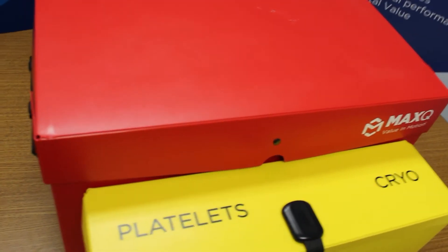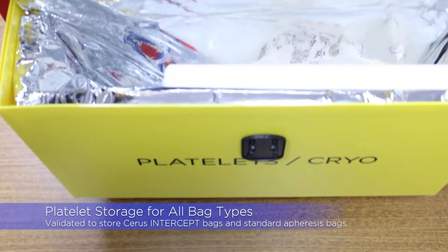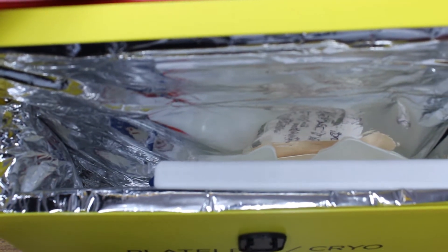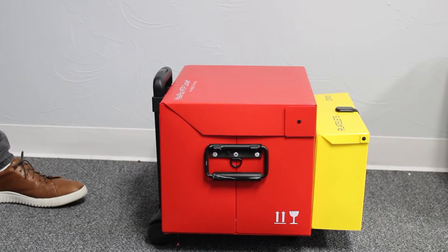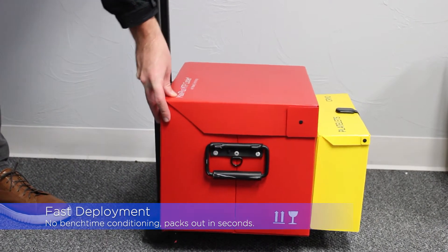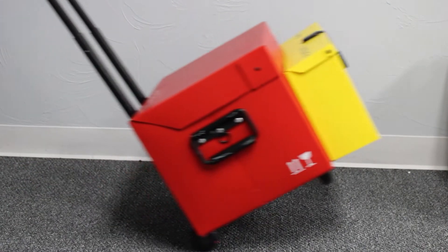This cooler can carry up to 6 units of red blood cells, 6 units of plasma, and 2 units of platelets at the same time. Designed with convenience and speed in mind, the MTP 2.0 has no bench time conditioning and can be packed out in seconds. Transportation of the MTP 2.0 is easy with its built-in roller cart.